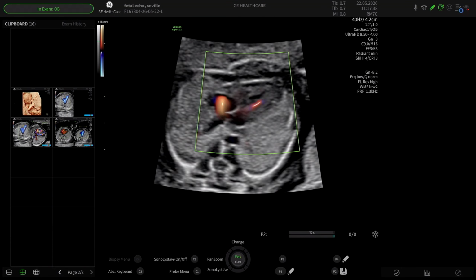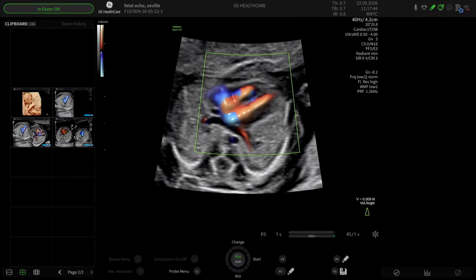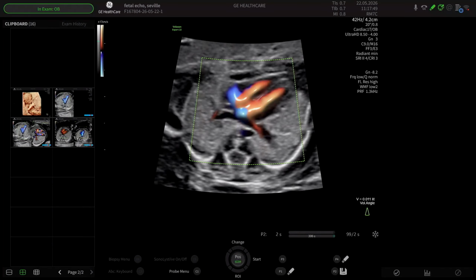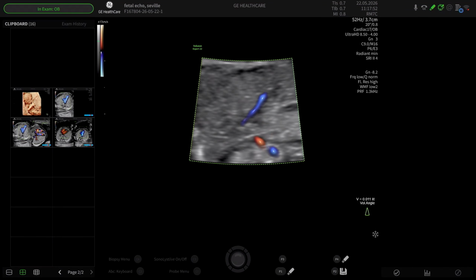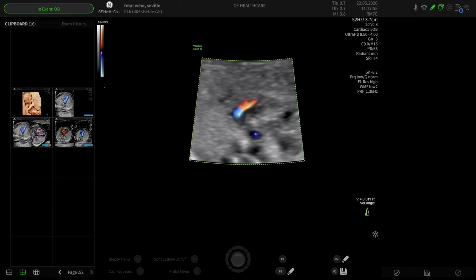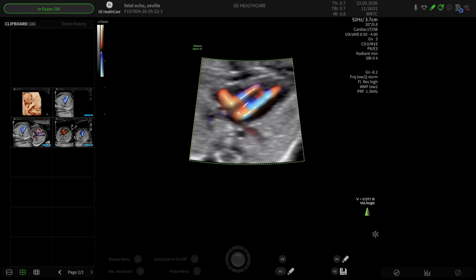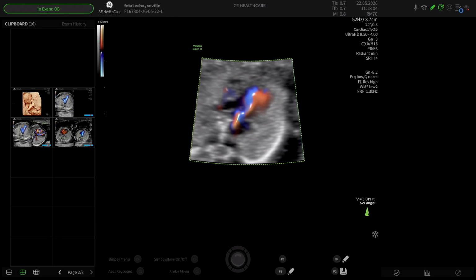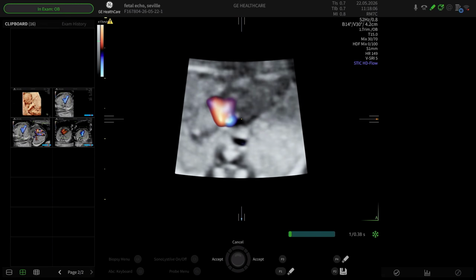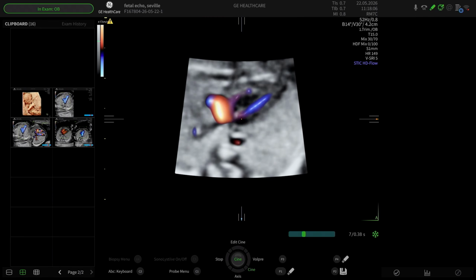And I will do one more, and this time I'm going to increase my angle to 30 and just do another sweep and just check up before I acquire, check my positioning is okay. Otra vez, no respira, por favor. So, 5, 4, 3, 2, 1, and respiro otra vez. Okay, so then we have accept, and we have a better volume, I think, this time.